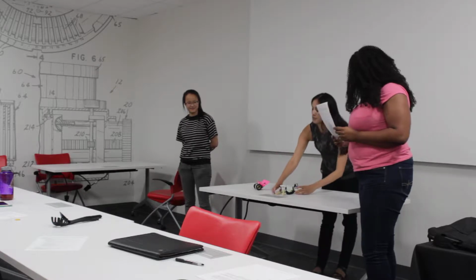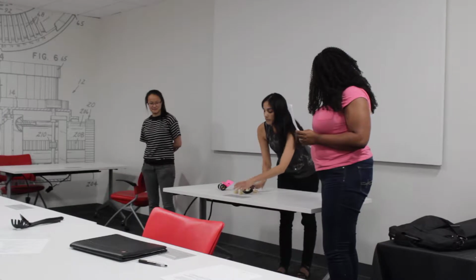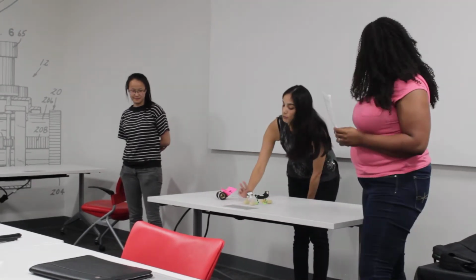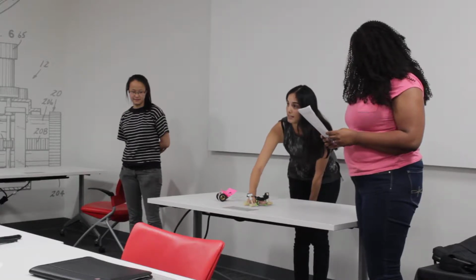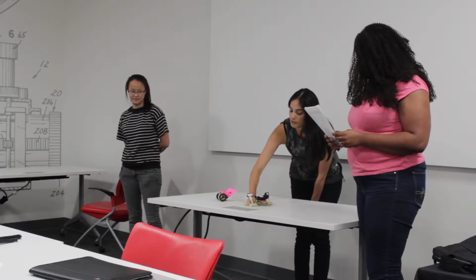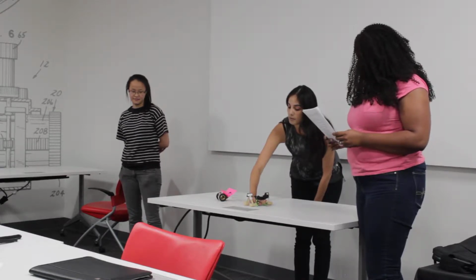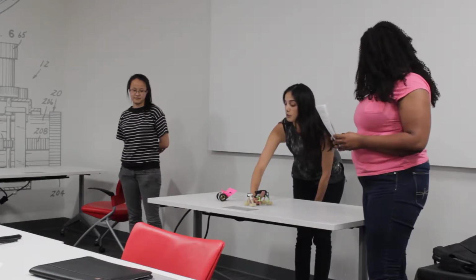So this is our prototype. It's a bit small. I hope you can see it. The idea is that a person in a wheelchair rolls up to it, bends over, rolls up more until the bar is behind his back. Then, while he's in this situation, he puts the t-shirt over the hooks and his arms in the sleeves. When he starts to sit up, the bar is pushed back and the hooks are pushed up, also pushing up the arms.